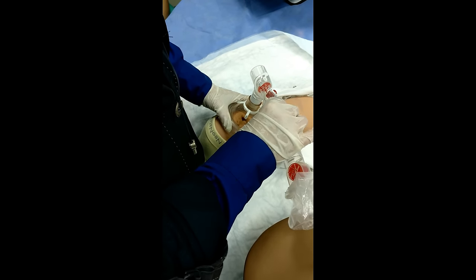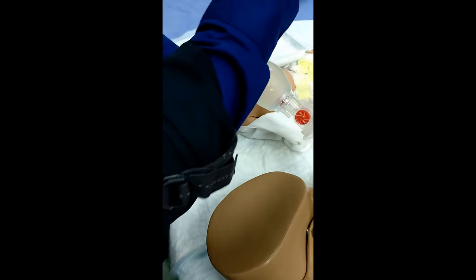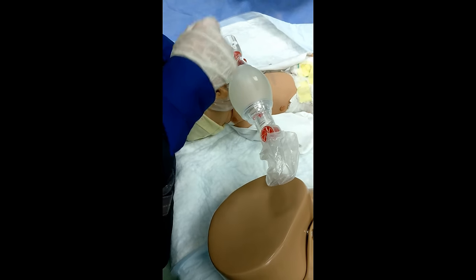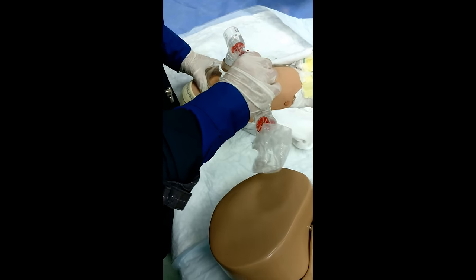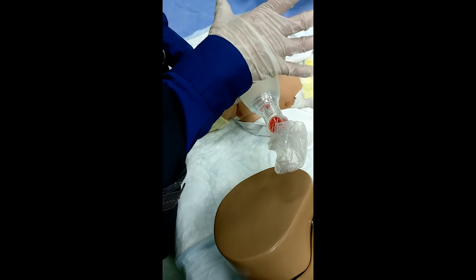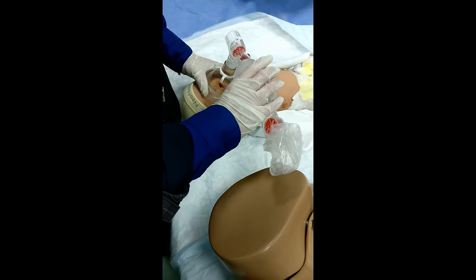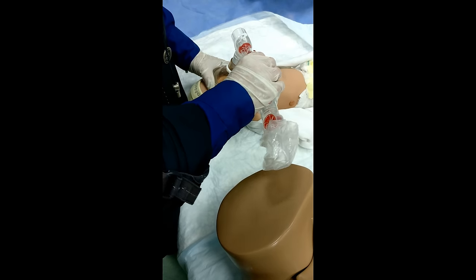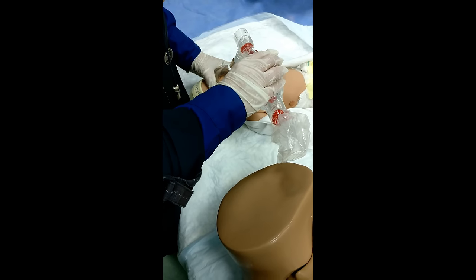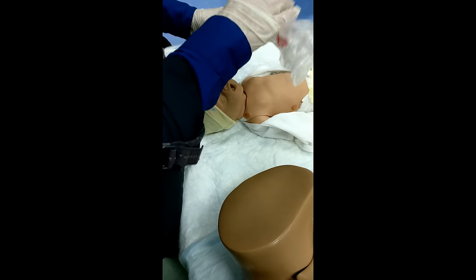1, 2, 3. First will be 5 inflations to check, and we look at the excursion of the chest. We'll change the mask, it's too big for this baby. First 5 inflations, but the rhythm is about 40 per minute, 40 to 60 in a normal ventilation. And the rhythm is in a waltz rhythm, 1, 2, 3. We'll look at the technique and at the rhythm, you should explain to us.